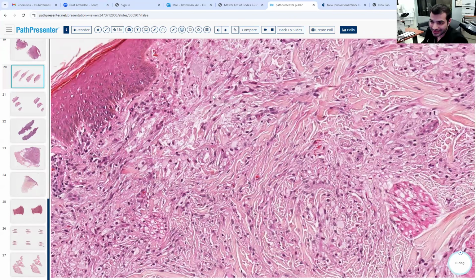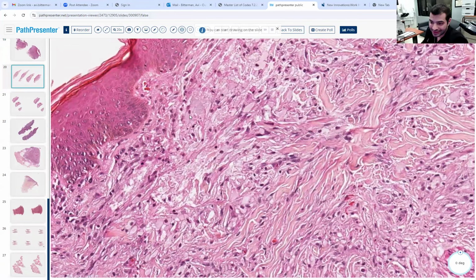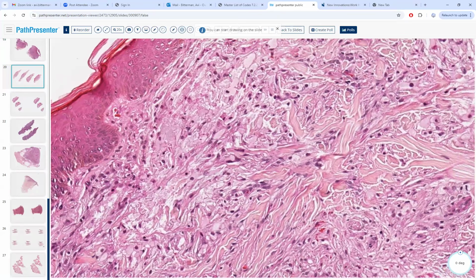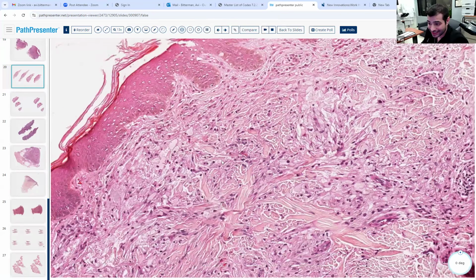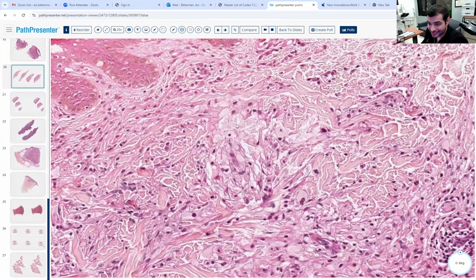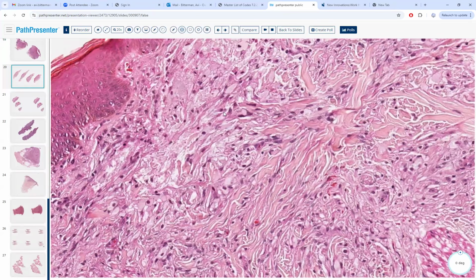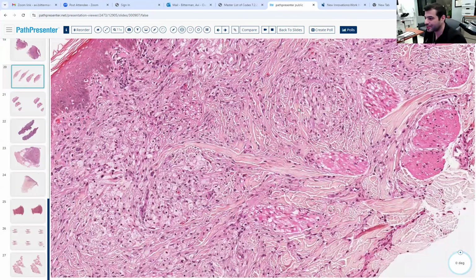And what else is there? Fibrin or mucin? There's foamy cells and there's foamy stuff outside of the cells. Just droplets of fat. The fat erupted too quickly and just spread everywhere. Eruptive xanthoma. Yes, exactly. So it makes sense, both clinically and histologically.